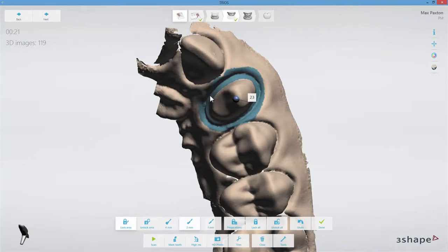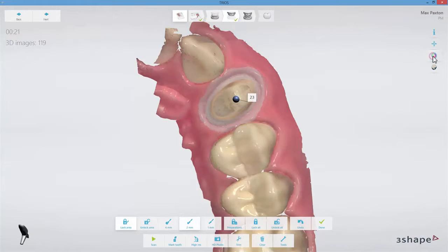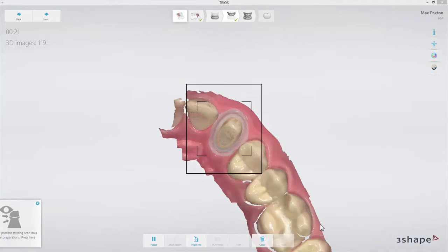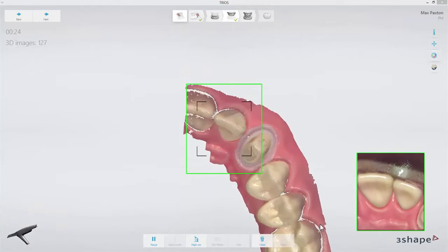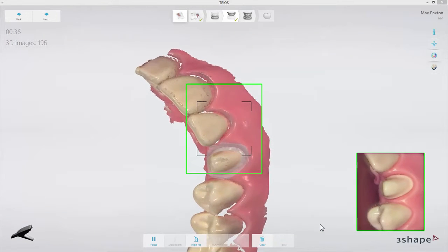When the selected area is OK, click Done. Now start scanning the rest of the jaw. The locked area will not be updated by further scanning.